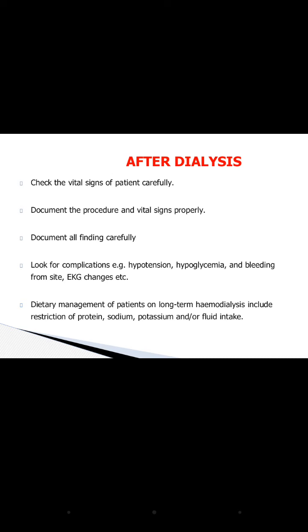Vital signs are checked every 15 minutes for the first hour, and then hourly for the next hours. The vital signs, the weight of the patient, and the lab findings are written. So all these need to be documented.